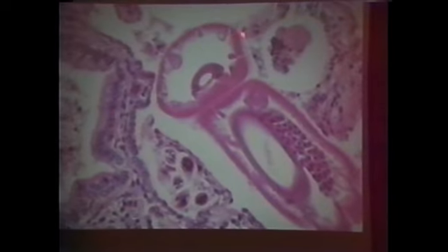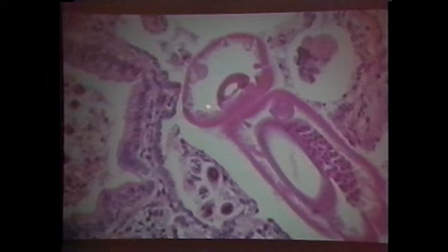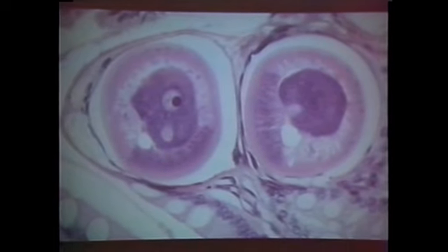And sometimes you really don't have anything that sticks out as a lateral cord, but you have accessory cords. That's the hypodermis coming out. And sometimes you have strange nematodes that don't have lateral cords at all. And those are your aphasmids, which is a group that we'll talk about later. You see nothing. This is all muscle-like, and then you have this nice little structure as well.